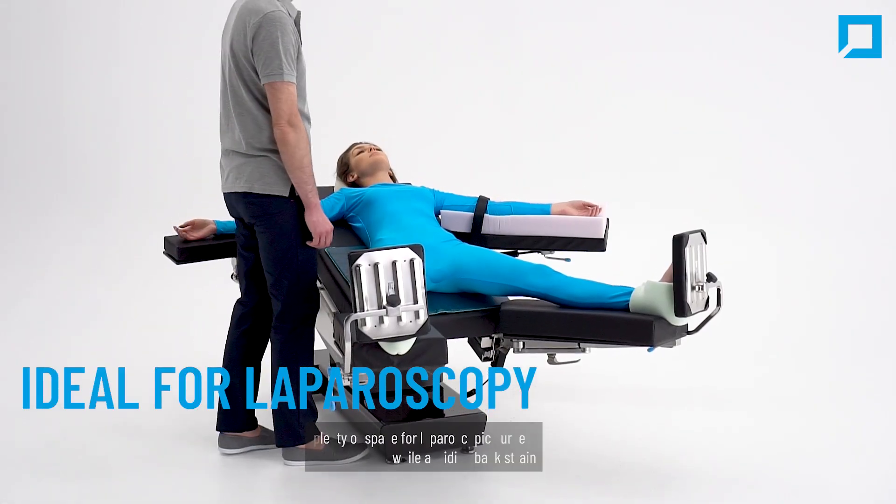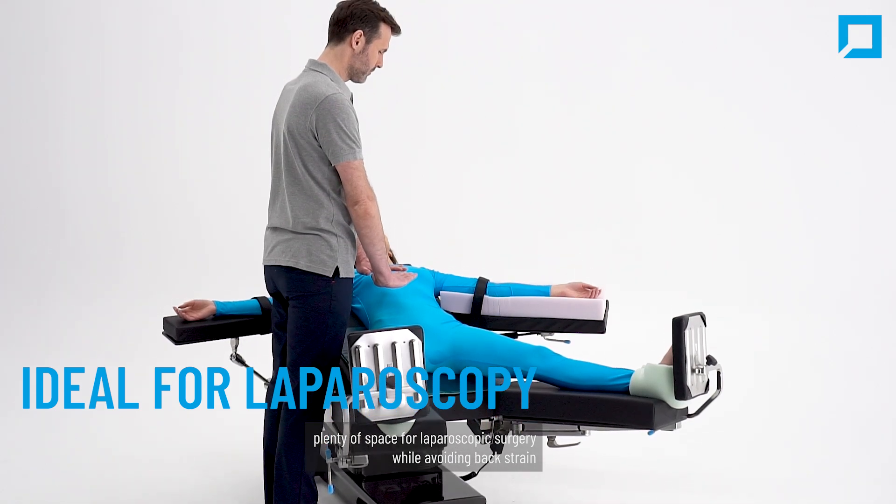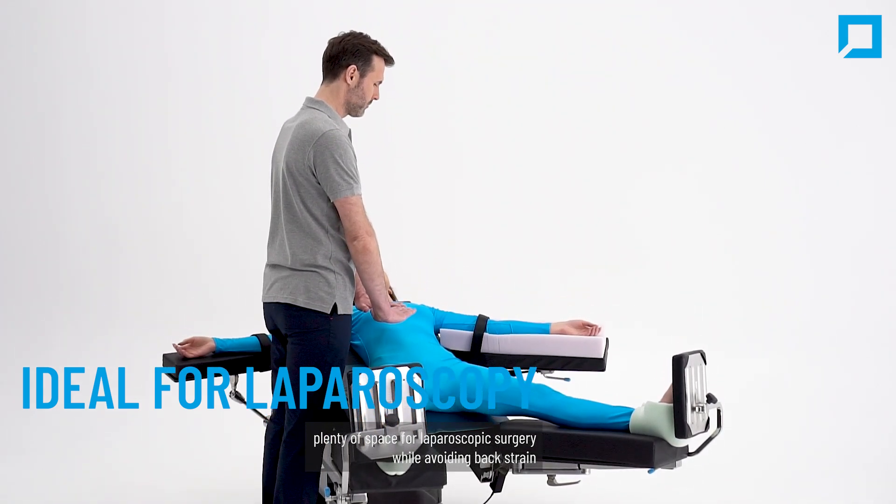It is a perfect fit for laparoscopy procedures. The low height offers plenty of space for laparoscopic surgery while avoiding back strain.